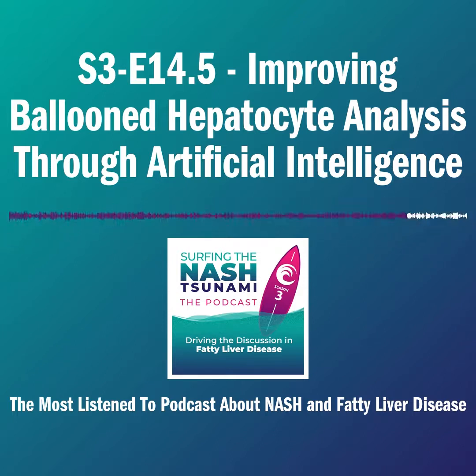But at the moment, we're working by basically comparing our non-invasives to histology. And the problem there is that without a standardized read, for all the reasons of variation that we've been talking about here, it means that we're comparing a non-invasive test that might be highly accurate to a potentially less accurate reference. So one of the immediate applications for this sort of work is to be able to standardize our histological assessments as the reference point for the further development and validation of non-invasive biomarkers.